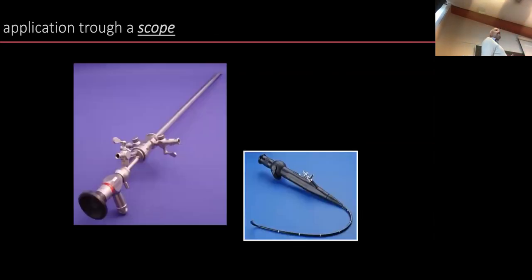A little bit less invasive is the use of an endoscope, and we have 2 types of endoscopes. One is rigid, you cannot move it around. It's a little bit bigger, and you can use high-end optics there, so the image quality is very high. But we also have flexible scopes. Flexible scopes usually have a chip on the tip, a very high-end sensitive camera. They go up nowadays to HD or even 8K.